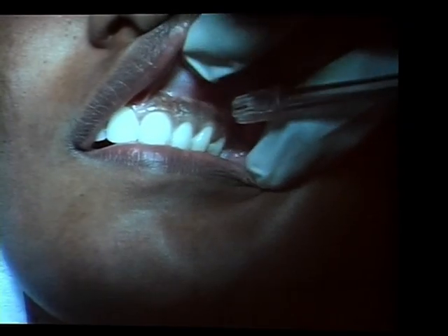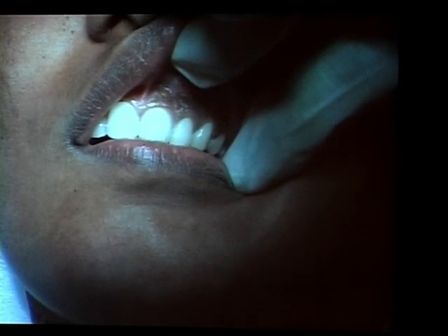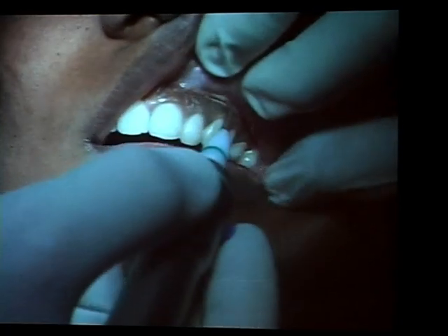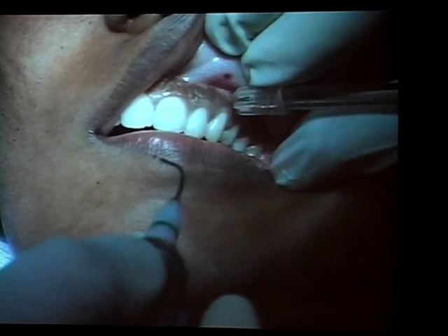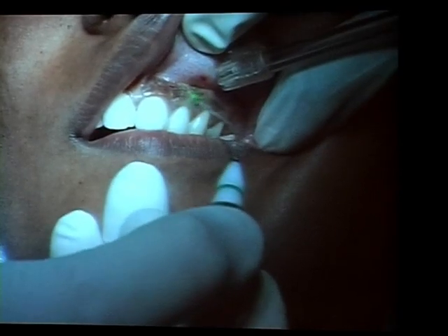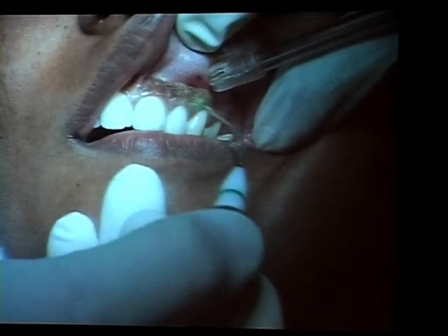Now we'll try a little bit more power in continuous wave. So let's use 0.75 watts. It actually takes about 0.8. It's so quick. Could you please switch it up? Perfect. So we're a little bit faster with 0.8 watts.